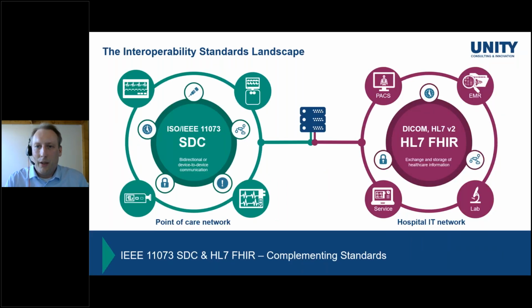On the left side, in the green circle, we have, from my perspective, a point-of-care medical device interoperability standards family, which is IEEE 11073 SDC. This standards family addresses basically the key aspects that I just mentioned before: time synchronization, plug and play, risk management, as well as cybersecurity. The green ecosystem, from my perspective, focuses on the customer needs and use cases that are primarily related to using live data directly at the patient bedside for maybe the immediate management of the patient and decision making. That's why I would also integrate our device A using standards protocols from the green side of this picture.